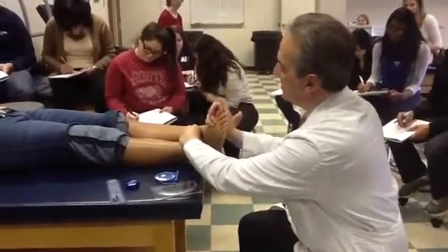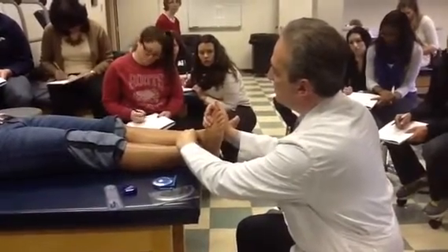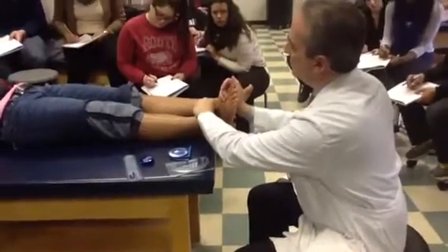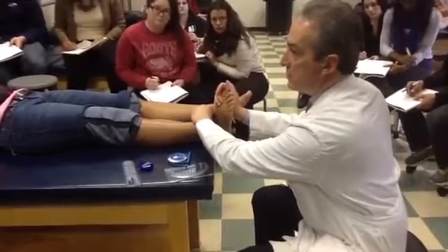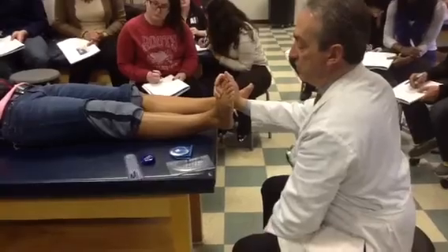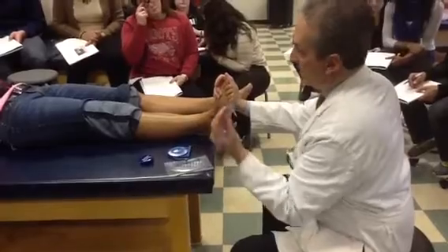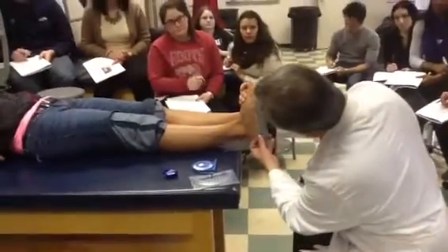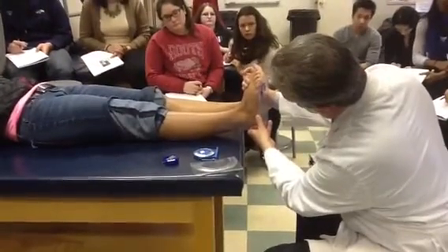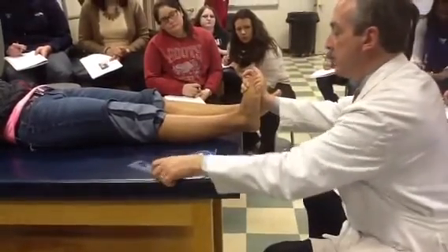One of the things I want you guys to do is, since we have to put the subtalar joint in neutral position for several measurements, I'm going to come around and work with you guys on subtalar joint neutral so you can really get a feel for what that feels like. Okay? So we load, maximally dorsiflex, subtalar joint neutral, then we take our measuring tool. If I'm going to use, let's say, the tractograph, I'll have one line going from the plantar aspect of the calcaneus to the plantar aspect of the fifth met head, and the other line bisecting the lower 1/3 of the leg. It's easiest to do that with a tractograph.